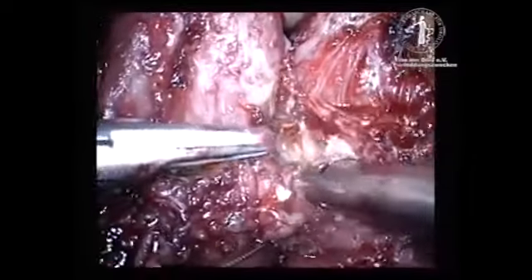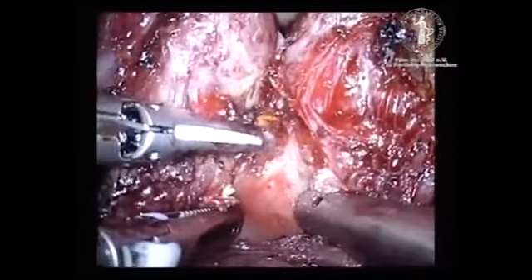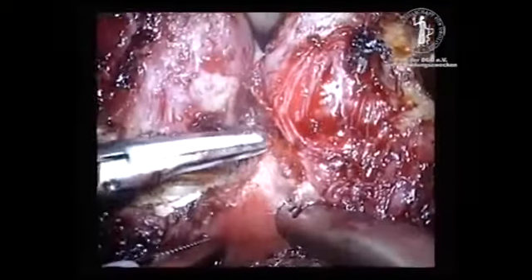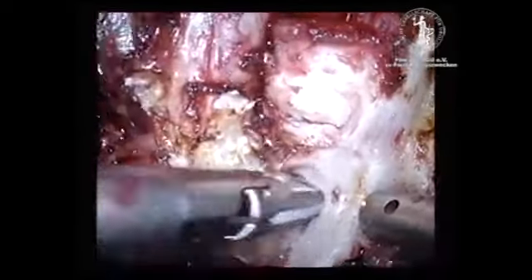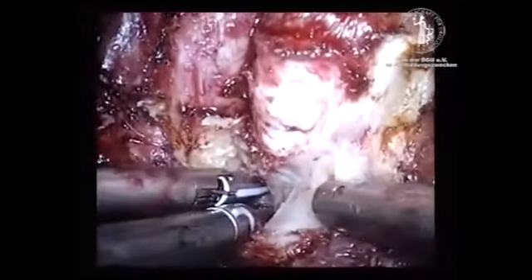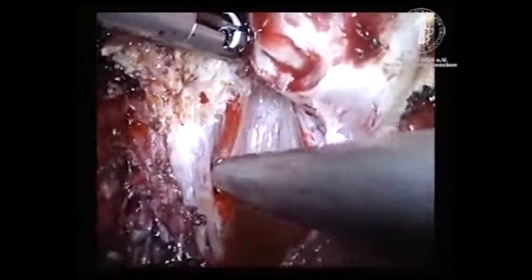The magnification of the laparoscope helps to identify the mucosa of the bladder. The mucosa is the key structure that leads our dissection. This will avoid any accidental intraprostatic entry, which may occur if the dissection is in too caudal a direction. Following complete dissection of the bladder neck, the ampullae of the vasa deferentia have to be visualized.